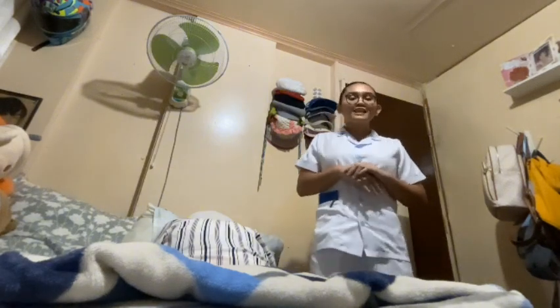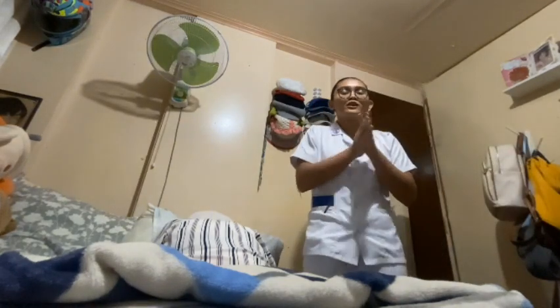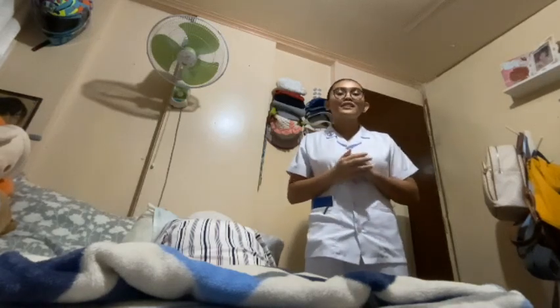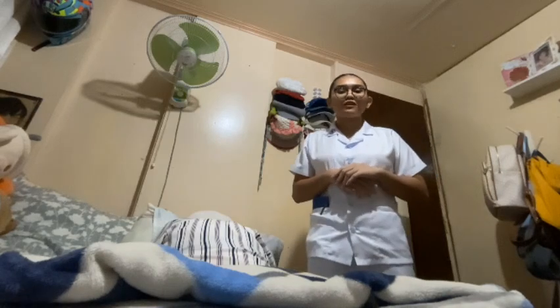Okay, thank you. After that, I must perform hand hygiene and observe appropriate infection prevention procedure to eliminate microorganisms and prevent cross-contamination of microorganisms. Then, I will provide patient privacy by screening or closing the door to protect the patient's dignity and promote comfort.